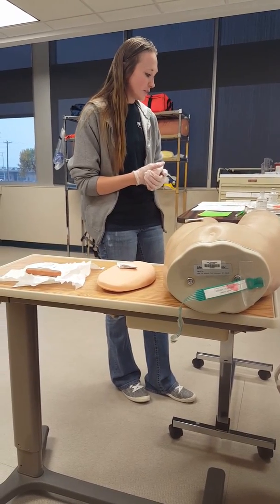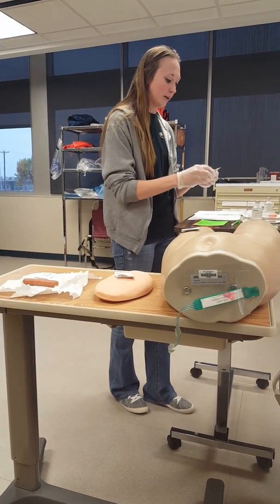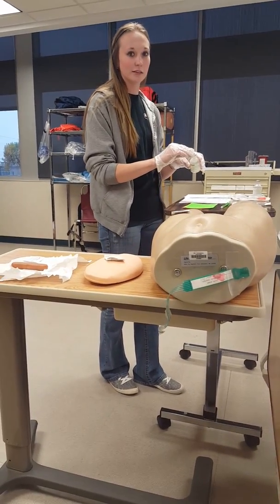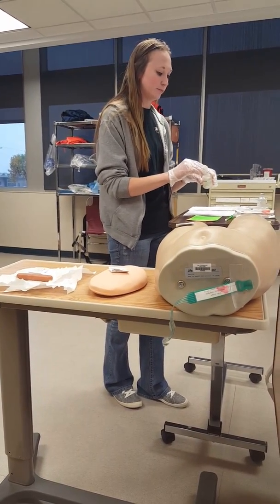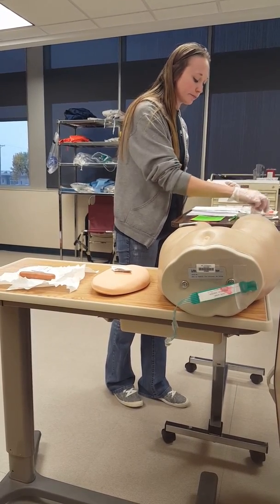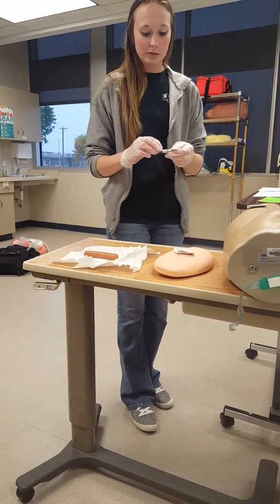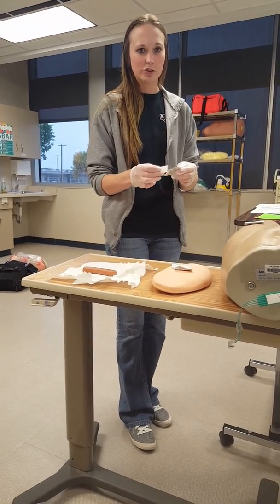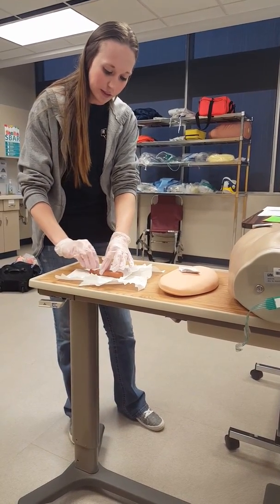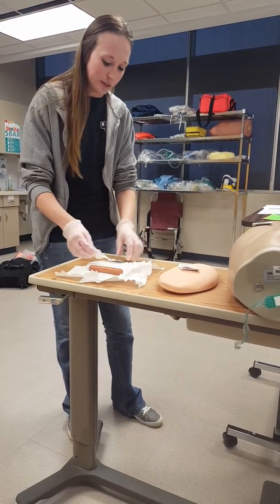So the first thing I'm going to do is disinfect my vial, and I would do this for 30 seconds, which I'm not going to for the sake of the video. And then I'm going to clean my spot, and this will be on your inner arm. So I could clean this for 30 seconds as well, but I won't for the sake of the video.